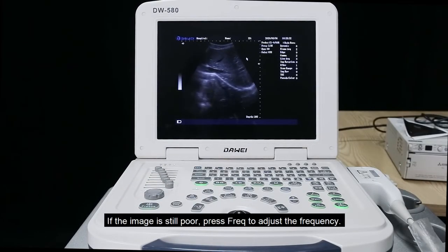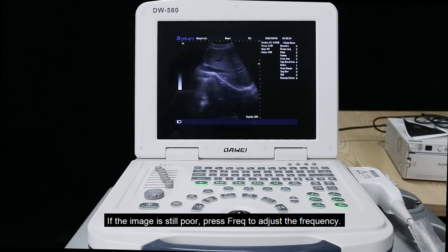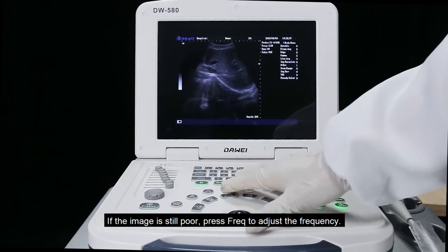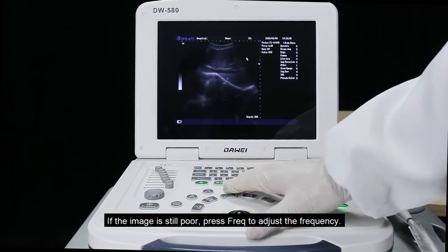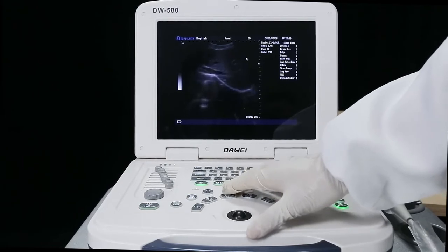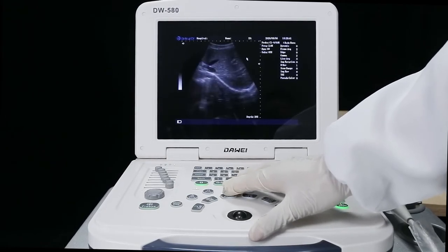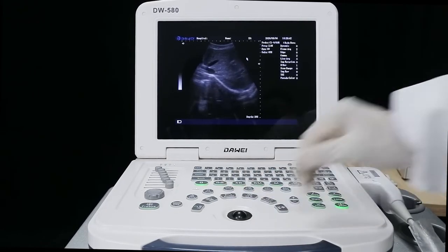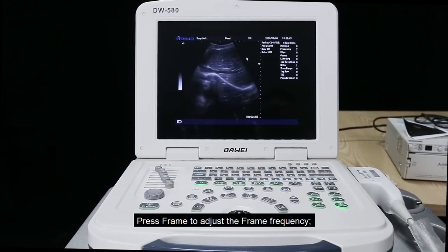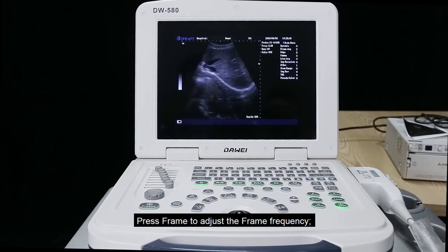If the image is still poor, press frequency to adjust the frequency. Press frame to adjust the frame frequency.